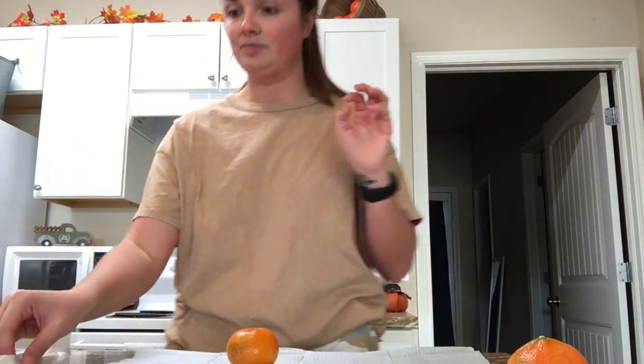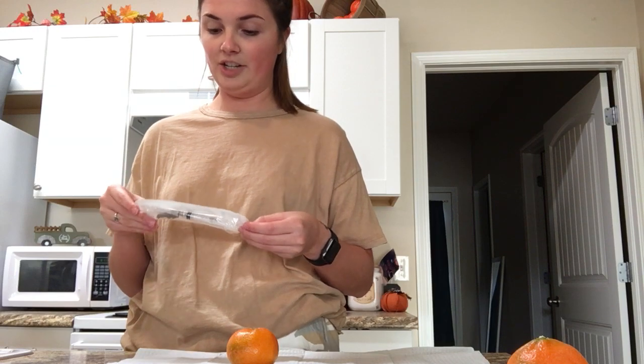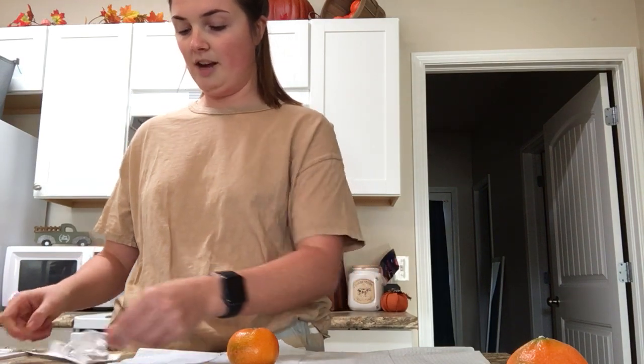I'm gonna first start by washing my hands and applying gloves. I don't have gloves, so we're just gonna pretend. So I'm gonna get my IM injection, the 3-milliliter syringe with a 22 gauge needle. I'm going to open it up. I'm not going to open it up all the way.